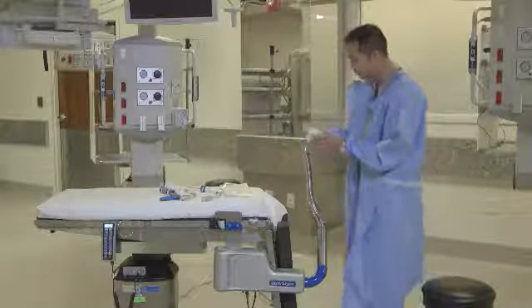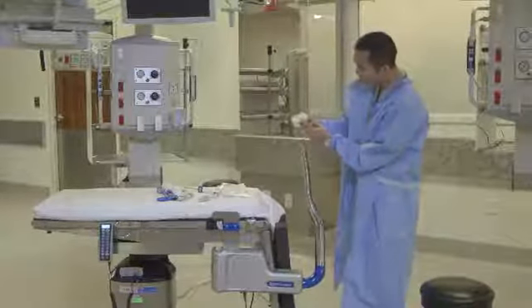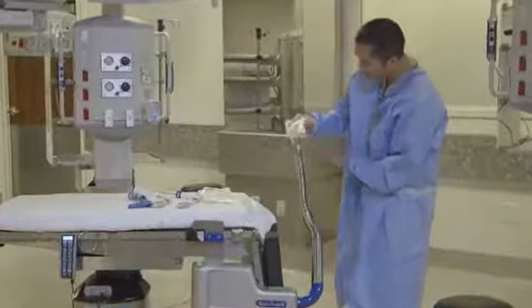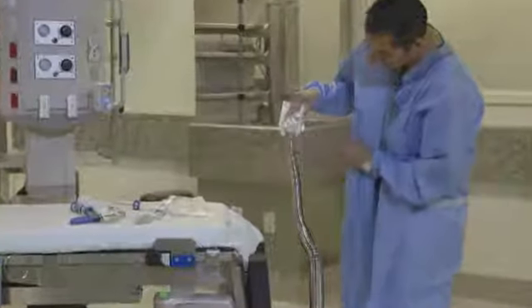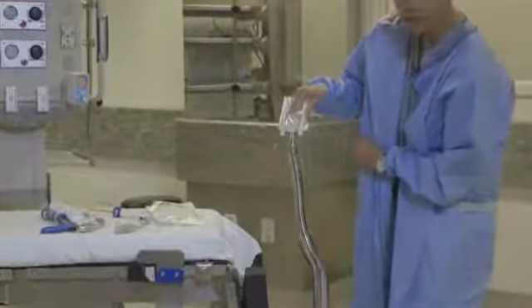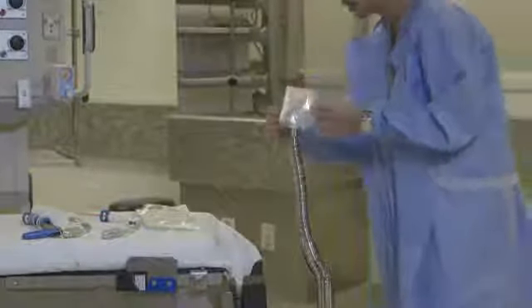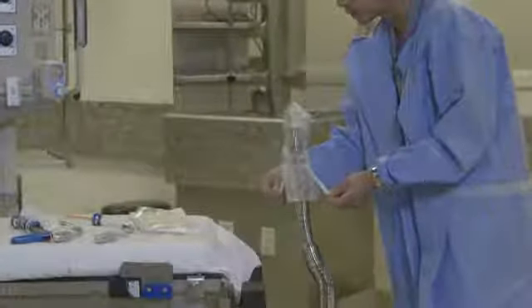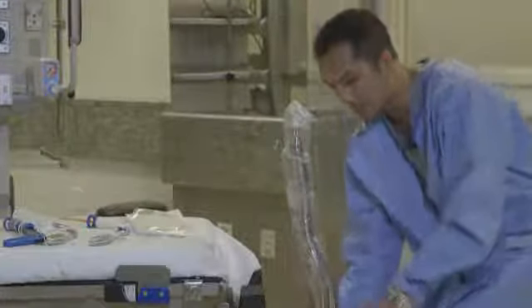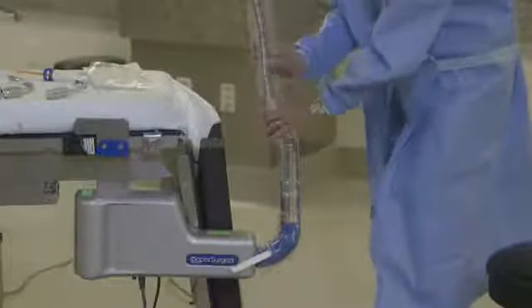And as you can see, I'm going to bring this in. There's an opening here at the top of the drape, and I'm going to just place that over the top here, and you're going to see that clip in. And you're going to hear it clip into place, right? When you hear that click, you know you're in the right location. Then you're going to grab these tabs right here that you see in my hands, and you're just going to pull that downward. And as you pull that downward, you're going to see how very quickly it allows you to drape the instrument. And then you can just adjust this.